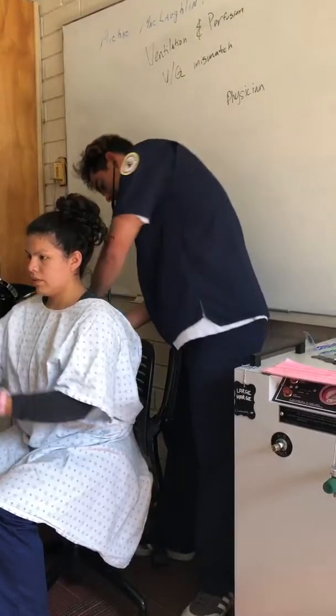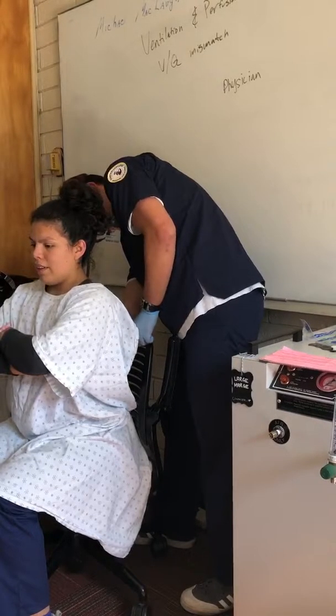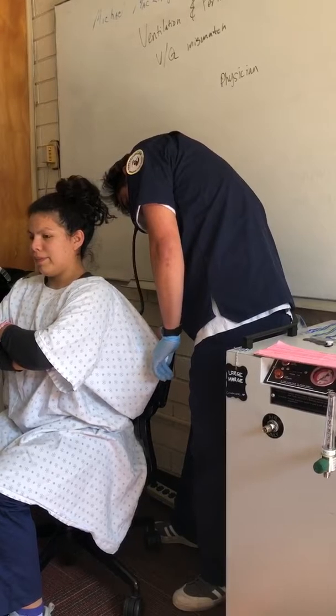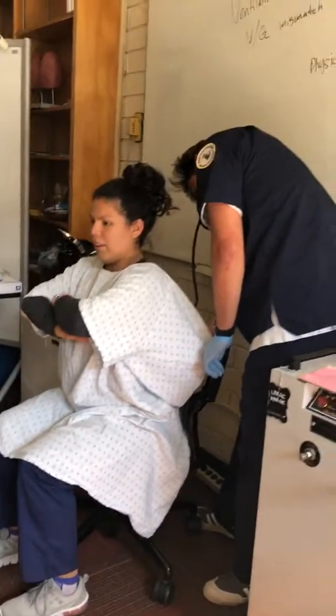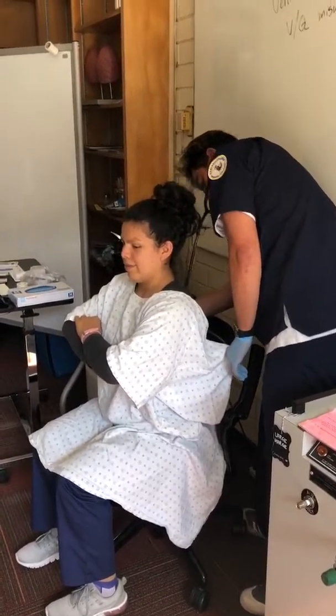These are going to be on your side, okay? So mid-axillary line. Thank you. Okay, mid-axillary, a little closer to your armpit. Okay, same on this side. Perfect, thank you very much.